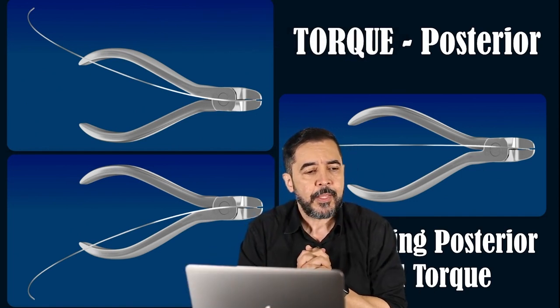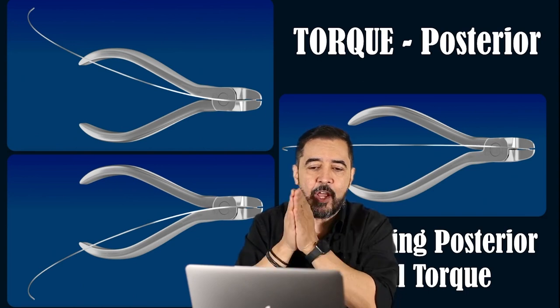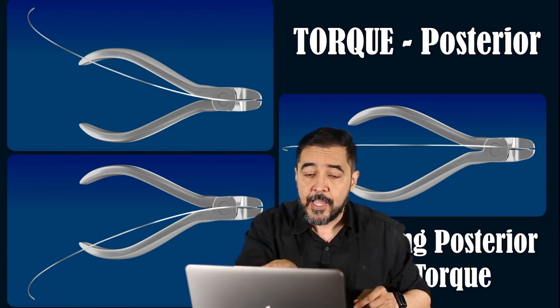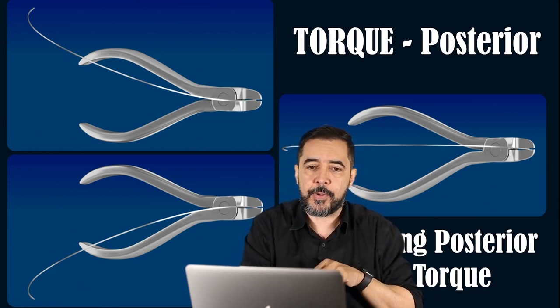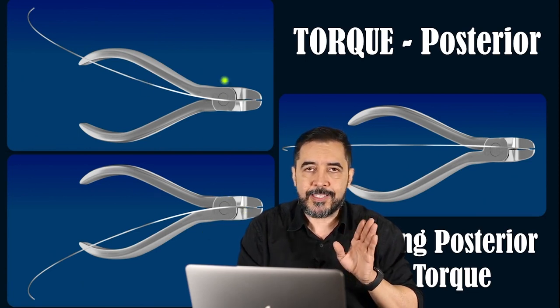But you have to remember that I'm not saying that every time that you insert the wire like this, you will always have a positive torque in the upper arch here, or a positive torque in the lower arch here. I'm not saying that.